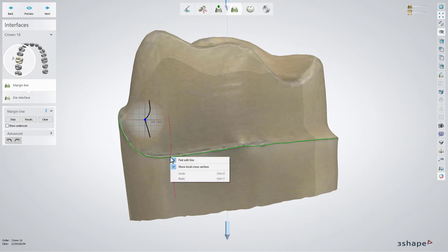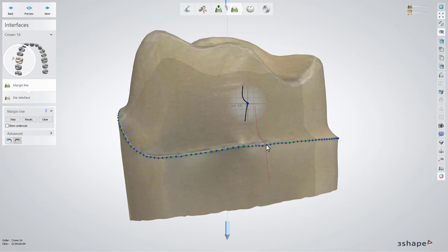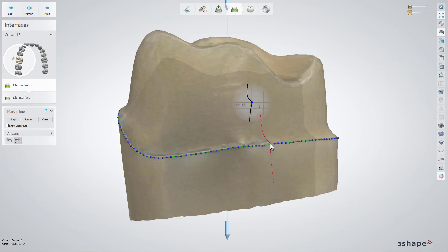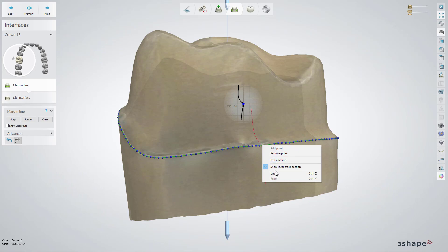Right click on the margin line or use the shortcut button F to see more options. You can disable the fast edit line and adjust the margin point by point, or add more points if needed. You can also disable the local cross-section here.